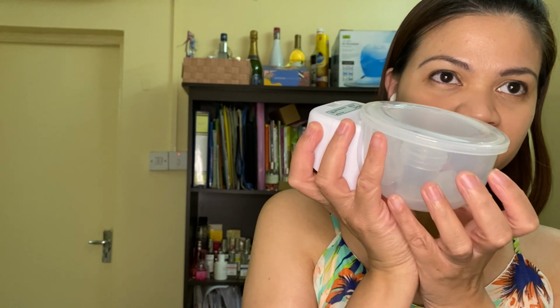And usually, because I'm a nurse, we don't have time to do a pumping session, although it's required by law. But when you're a nurse, you cannot do that. You don't have the freedom. So I know I will have that kind of problem when I return to work. What I have planned is to use this one while I'm on my break. I put this inside my nursing bra, and while I'm having my lunch or break time, I'm eating while I'm pumping at the same time.